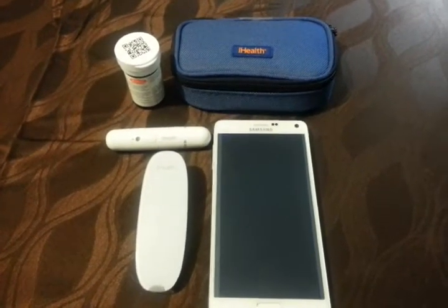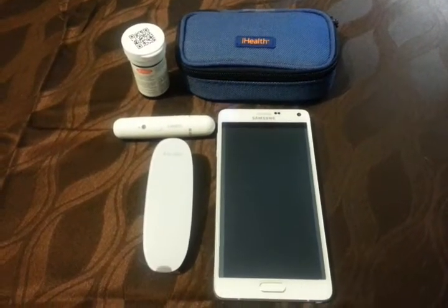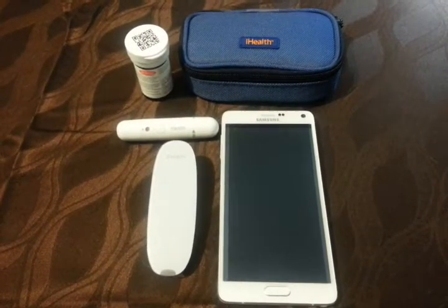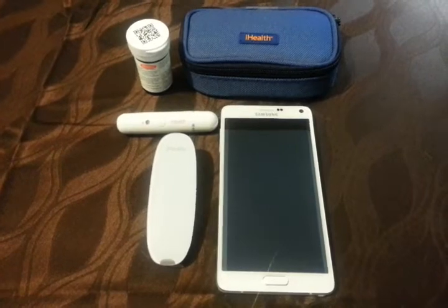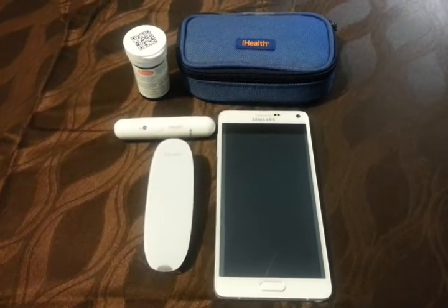Hi, it's me again. I just wanted to show you guys a little more in-depth on how I use the iHealth Glucometer, now that I know a little bit more about it and have it up and running. So here we go.